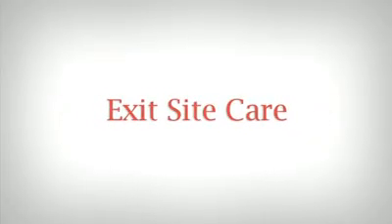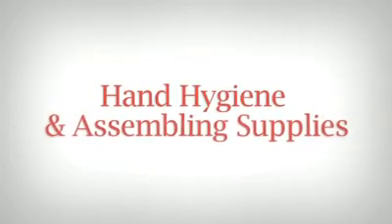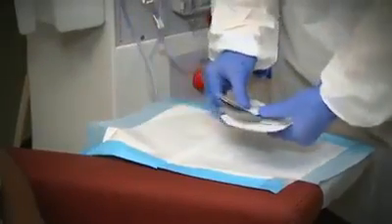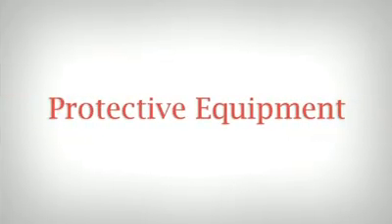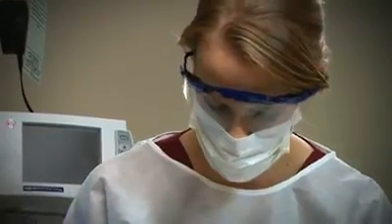Most dialysis patients with catheter-based vascular access use tunneled dialysis catheters. You need to inspect and clean the exit site. Before taking care of the exit site, perform your hand hygiene and assemble your supplies, including antiseptic agent, clean gloves, personal protective equipment, a new dressing, and antibiotic ointment. Because exit site care poses a risk for you to be contaminated with infected body fluids, you must wear personal protective equipment.